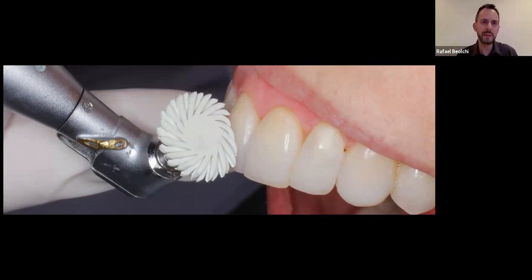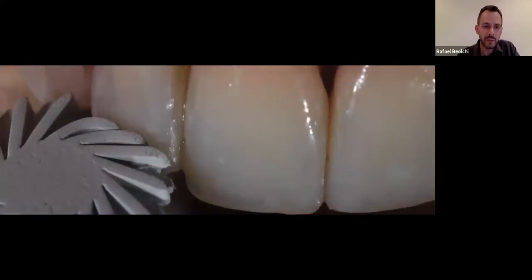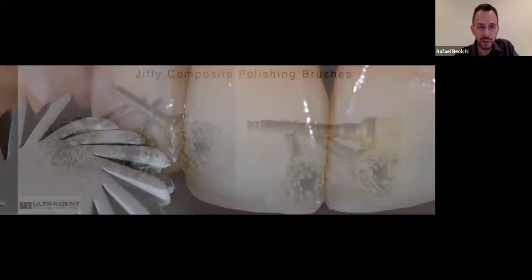Okay, so if you have available in your country, please do try, because you're gonna be amazed at how easy it is using the spirals as well. And this is what I'm saying about, you know, shock absorption. There's no way you can put too much pressure and generate too much heat there, okay? And remember, speed, 1/3 or less than those 30,000 RPM.